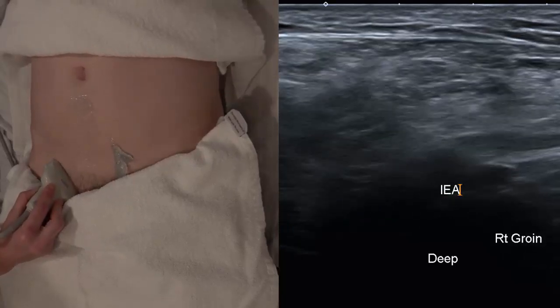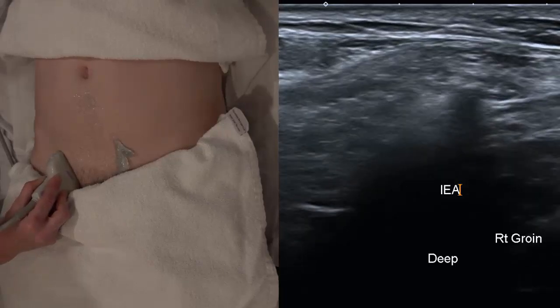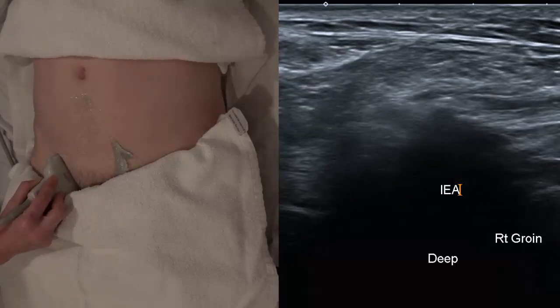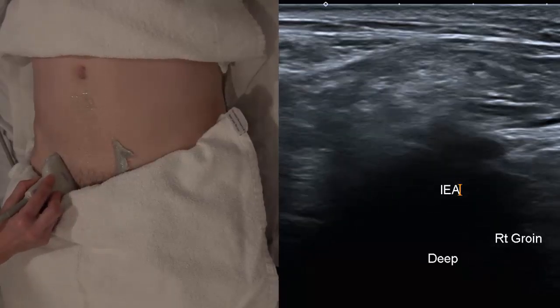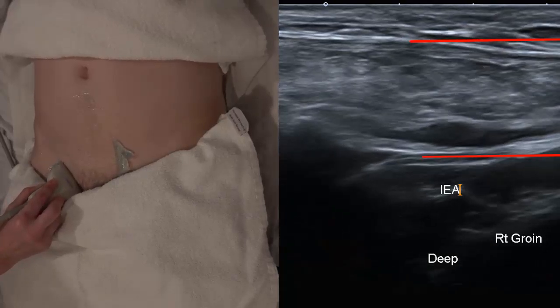You can assess it in transverse but transverse can be even more confusing. The ideal thing is to look and see if the hernia is traveling left to right across the screen, between its roof and the transversalis fascia and peritoneum.